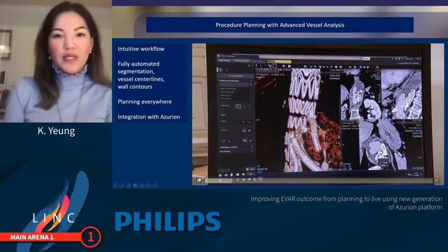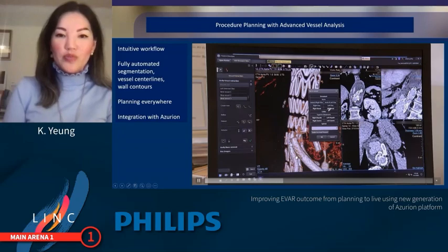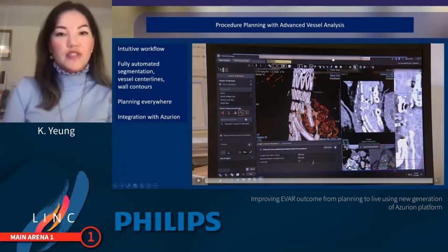Because there's a possibility that you just click on where the central luminal should be, and an automatic central luminal line will be provided by EVA, and also the length that we need for the minimal overlap of 40 millimeters and 65 millimeters for maximal overlap. You have this view in 3D, but also in other views.